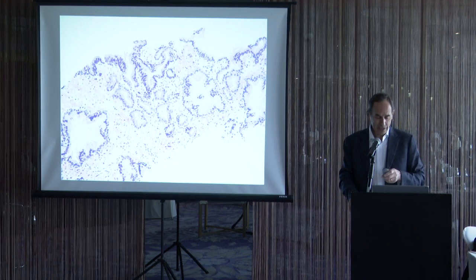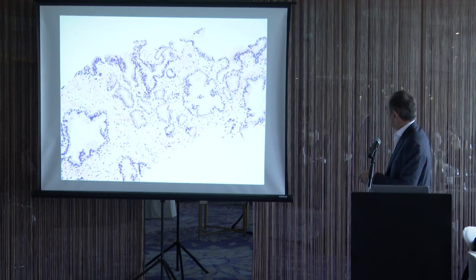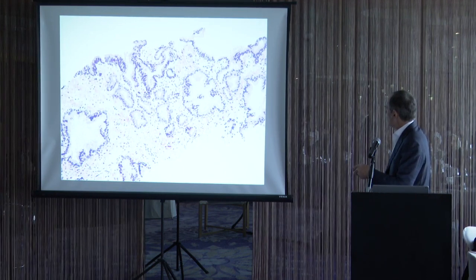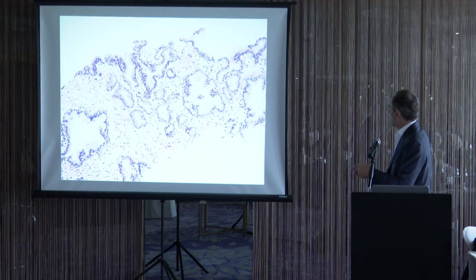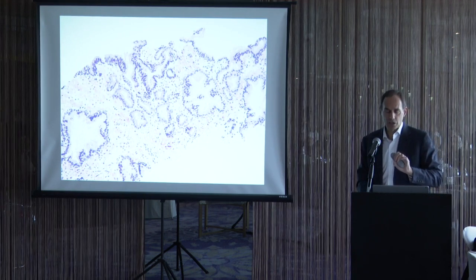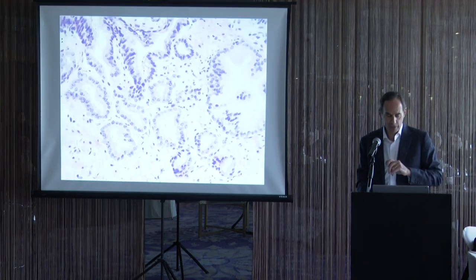That scenario comes into play when you see small glands suspicious for cancer, but they're adjacent to larger glands of high-grade PIN, which are pre-existing benign glands with infolding, big dilated glands. In that scenario, you have to be more cautious calling cancer because it could just be a tangential section off of the high-grade PIN.